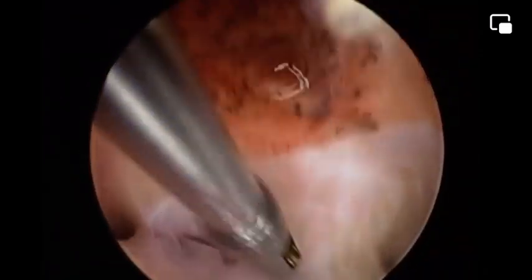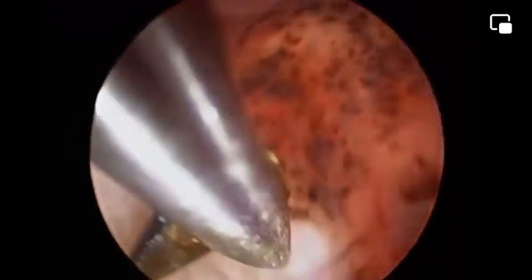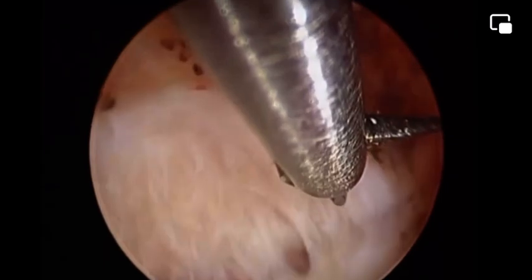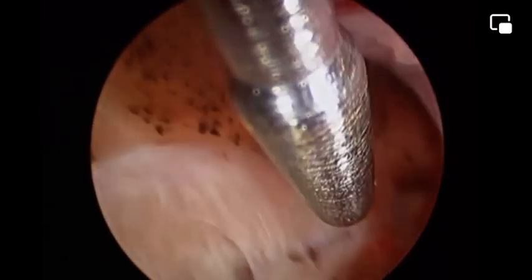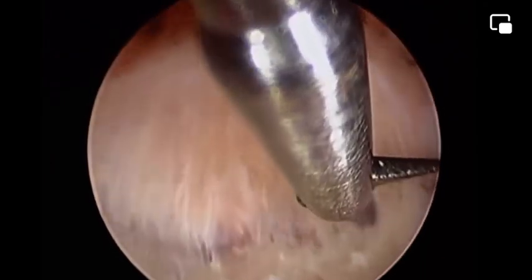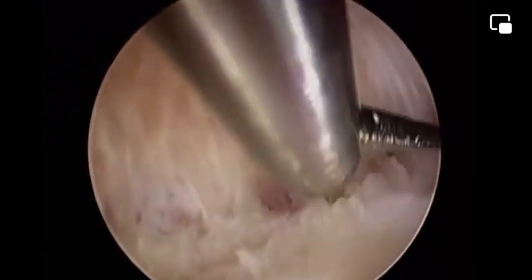So, working with the scissors actually requires more skill than working with the resectoscope. I mean in cutting, not in resection. In myoma, resection is different. So you have to train yourself how to work with the scissors by moving the scissors in and out to reach the pathology you want to cut, or fix the scissors and move the whole system in and out. So people ask me, Osama, which way do we do? Actually, you have to play both.